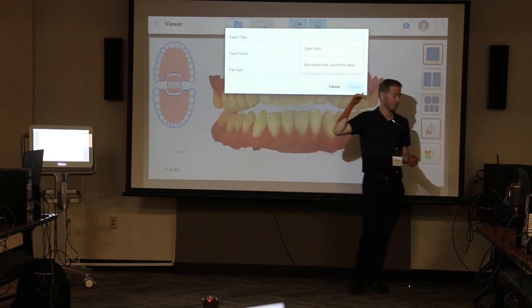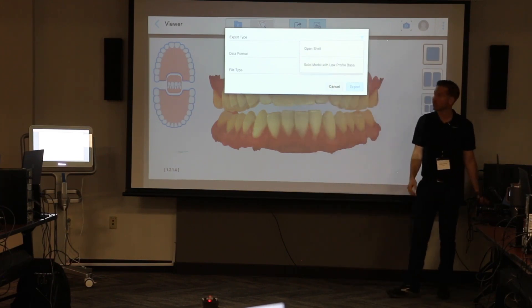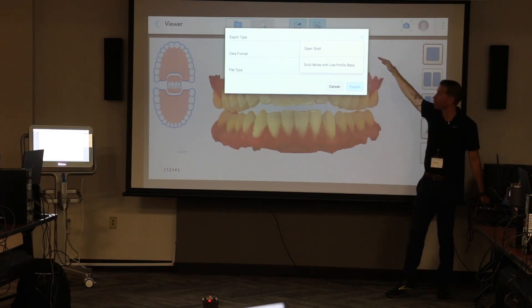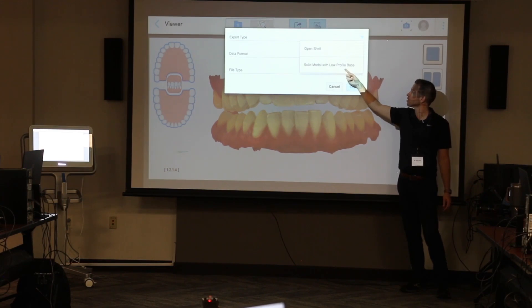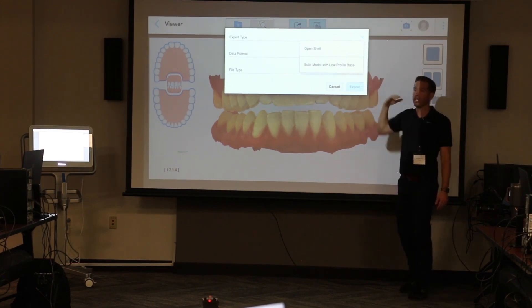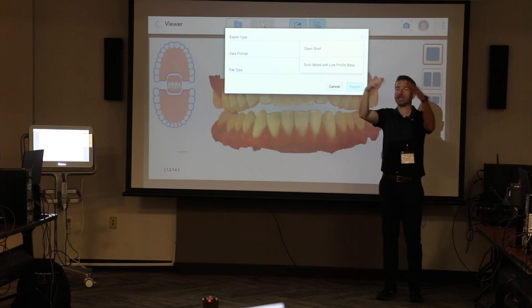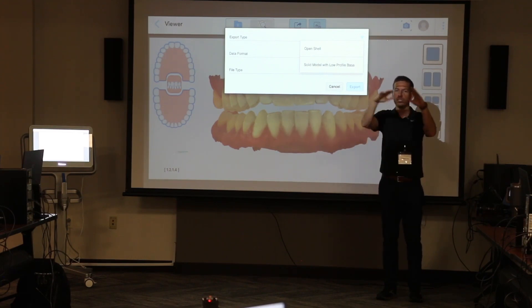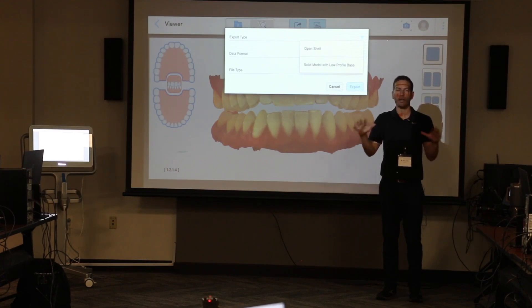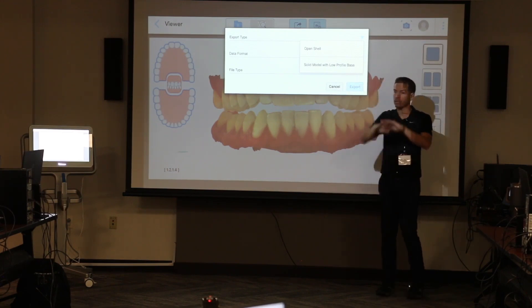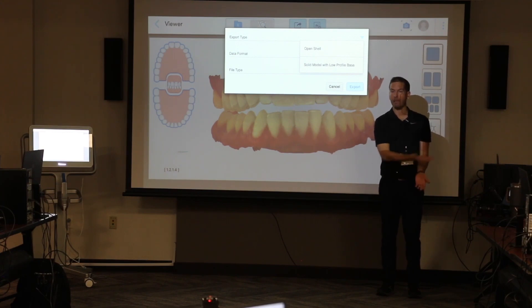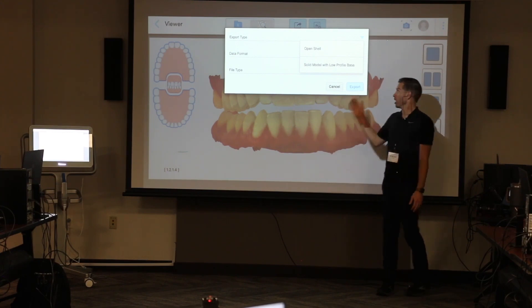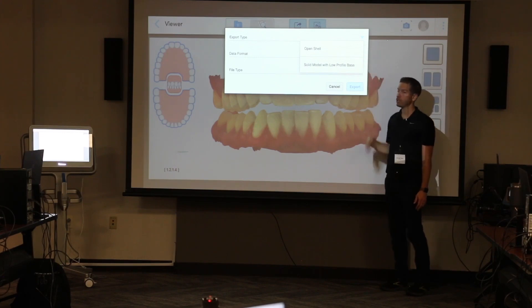There are really three questions you have to answer to get those files onto your desktop. The first one is export type: do you want to choose open shell or solid model with a low-profile base? An open shell is like a skin without a base — it's hollow underneath, one cell layer thick, and wide open. A solid model with a base is a watertight three-dimensional object with no holes and a flat base.